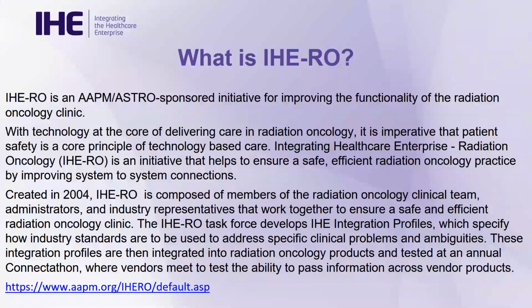And then I work for Philips, so I'm a vendor, but I used to be a clinical medical physicist, and one of my favorite parts about IHE, and what I think is one of the most important things that we do, is the connect-a-thon, where vendors sit in a room together and actually pass information back and forth to see if we meet the IHE guidelines.